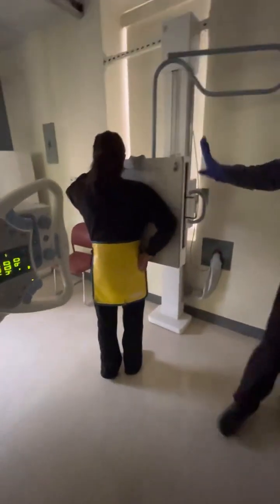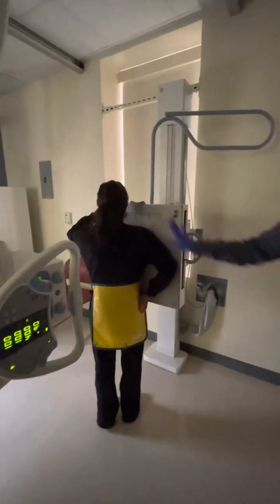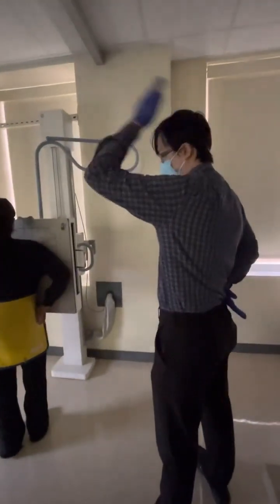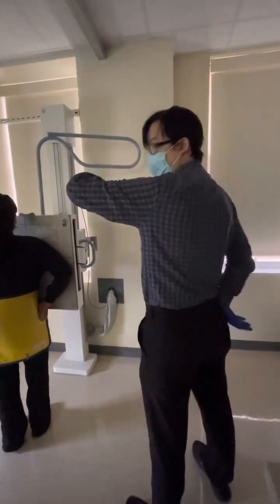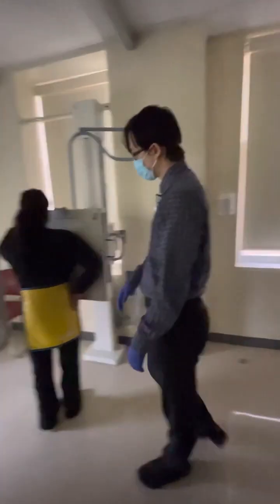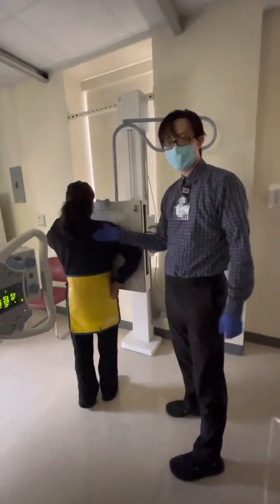Okay, so remember, PAs should look like this. Hand either on the buttocks or hand on the head, either one is fine. Other hand should be back here on the hip, on the butt, right? And then we've got a nice 45-degree oblique.